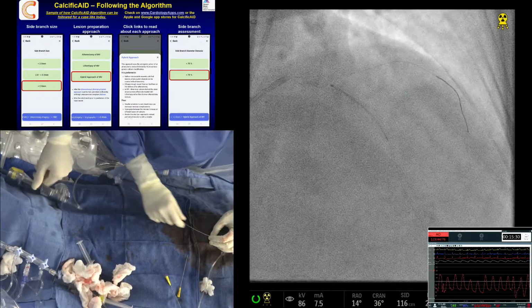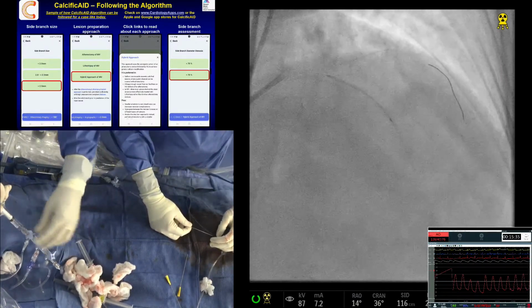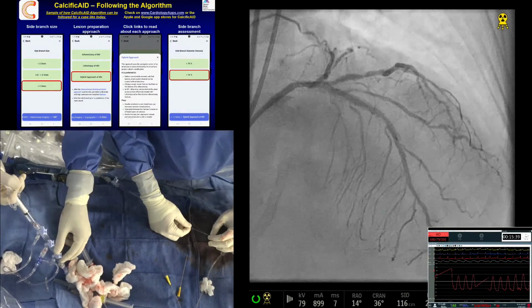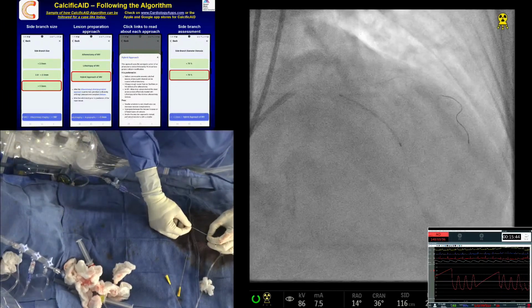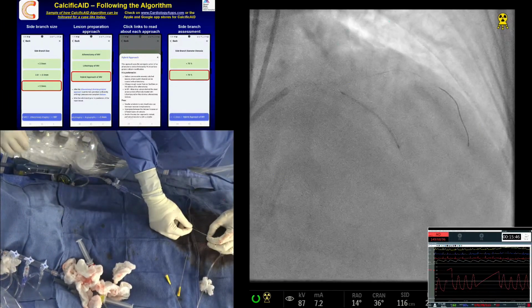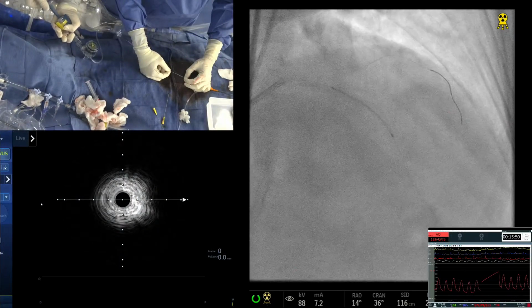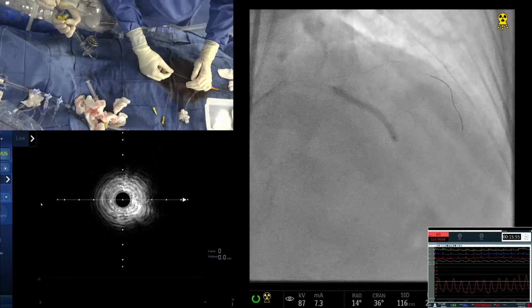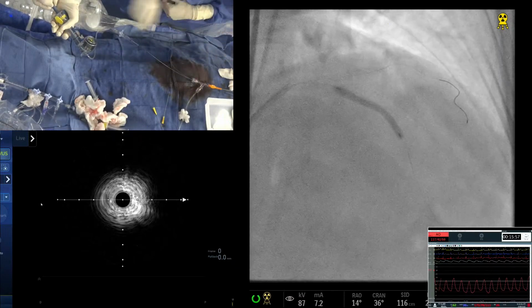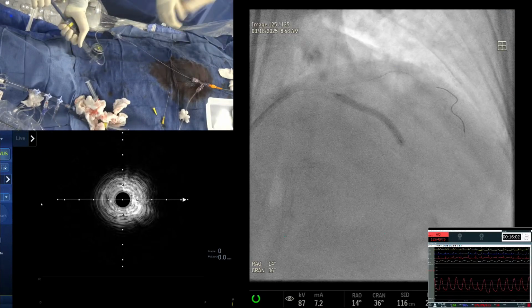Okay, some dye. Okay, take a picture. Ready? Kiski, a question for you. You're using the Boston Scientific system? Yes, this is definitely a 60 megahertz IVUS from Boston Scientific, with AI integrated Avigo Plus, with 16 millimeter first pullback. Max speed is 8 millimeter per second. Very time saving.